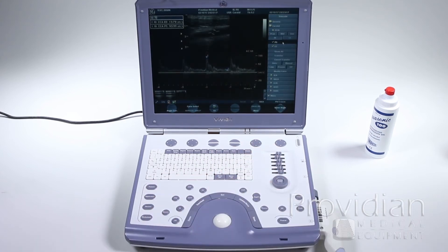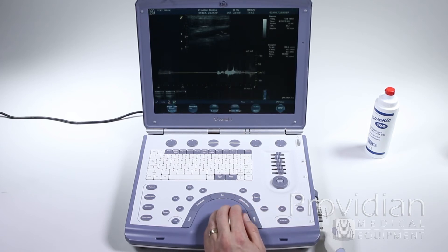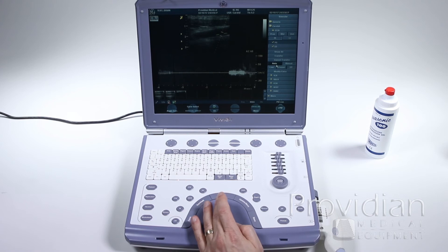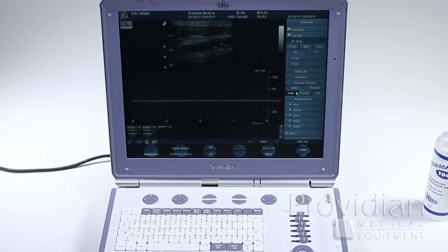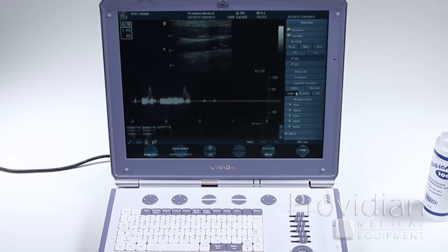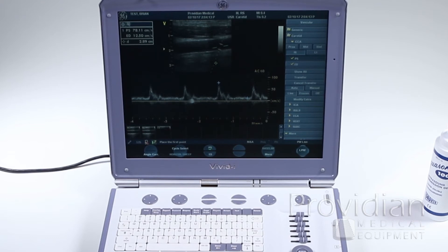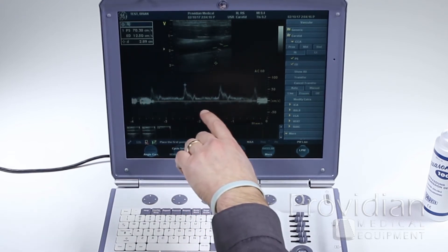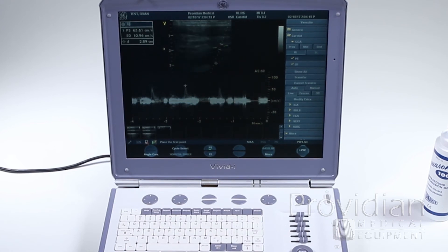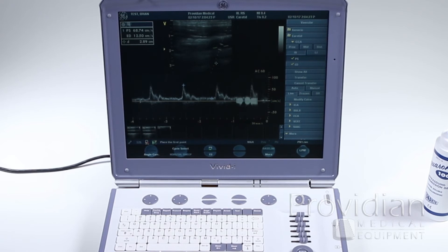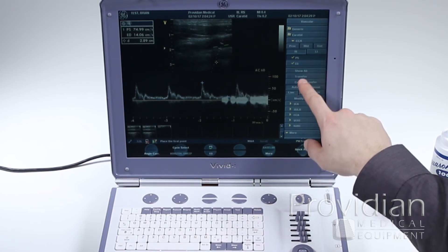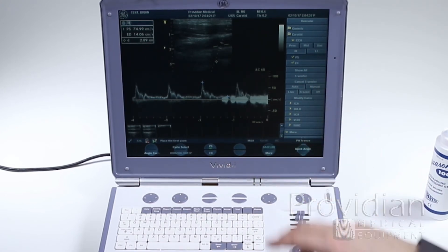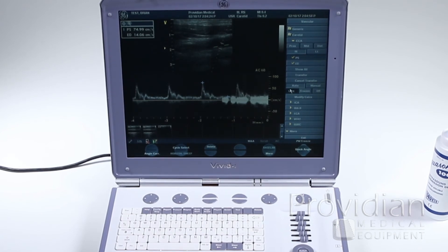We also have an auto calc feature. Click auto, then choose auto and live. As you can see, the live auto is choosing my peak and end for me as I go along. If you like what you see you can accept it, or you can do manual. Choosing auto then live automatically finds the peak and end for you. That's how you use the auto trace feature.